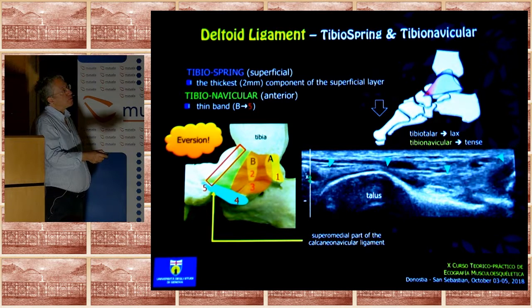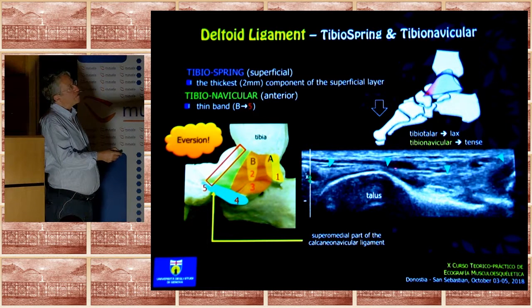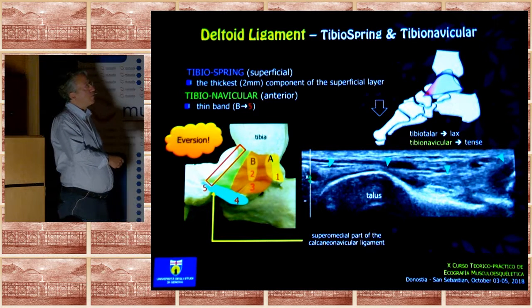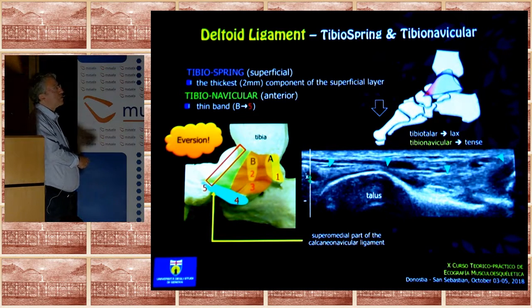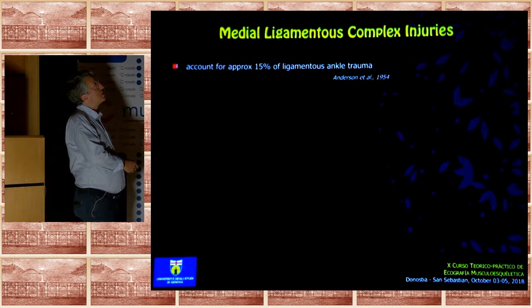You can see the proximal origin so nicely in general, but more distally the ligament is very thin, and if you don't have a perfect probe and a perfect patient, it's not visible. But remember that in many cases injuries occur cranially and not more distally.